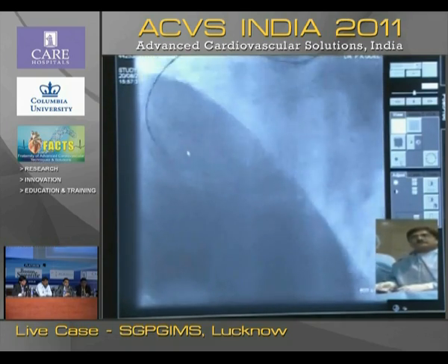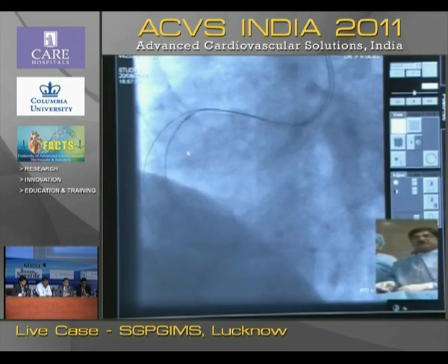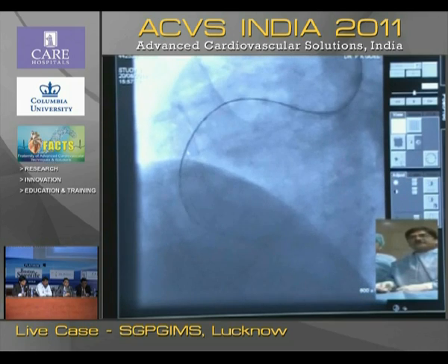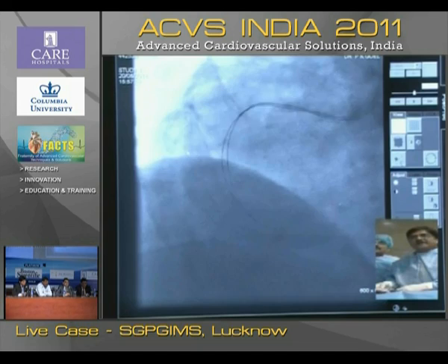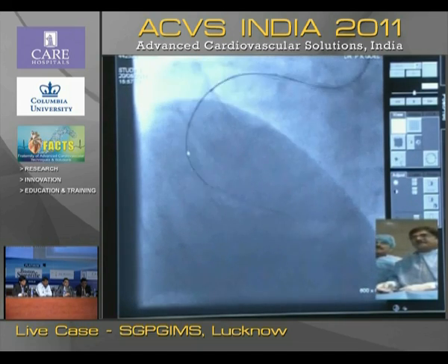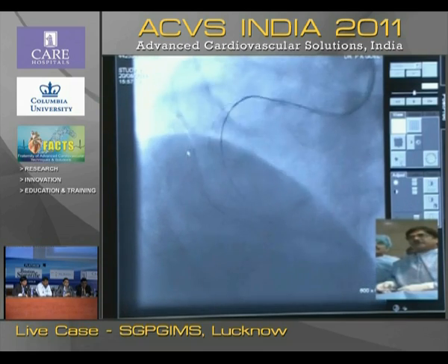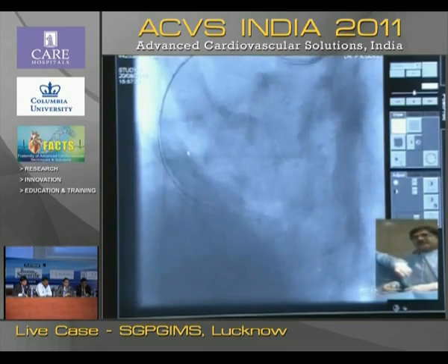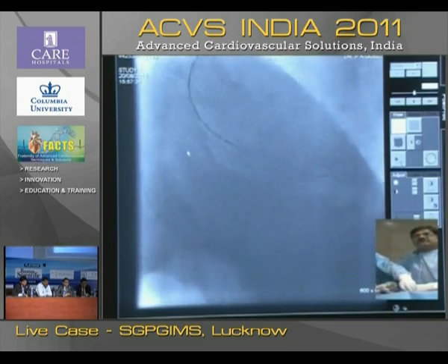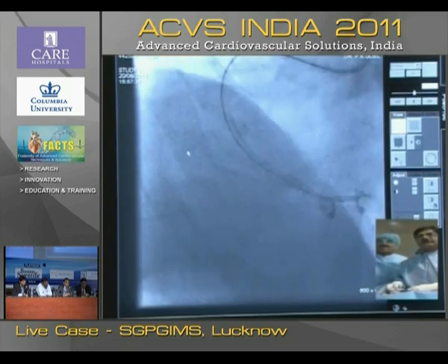Now these steps also have to be very careful, because there are instances where you might cross it all right and then get extra subintimal. So you have to really proceed very slowly, and I am just rotating still and I am not pushing it much. Test, please. I think that's fine. That's good. So now it's okay. Alright, maybe you can try your micro.